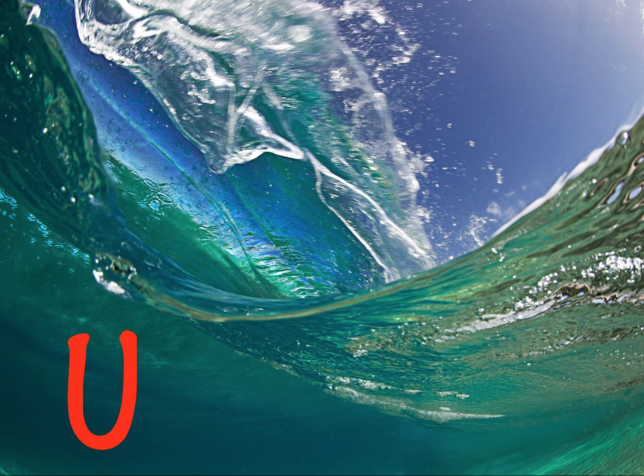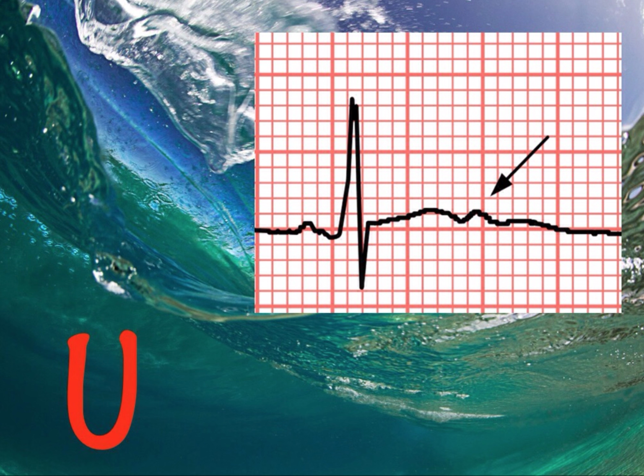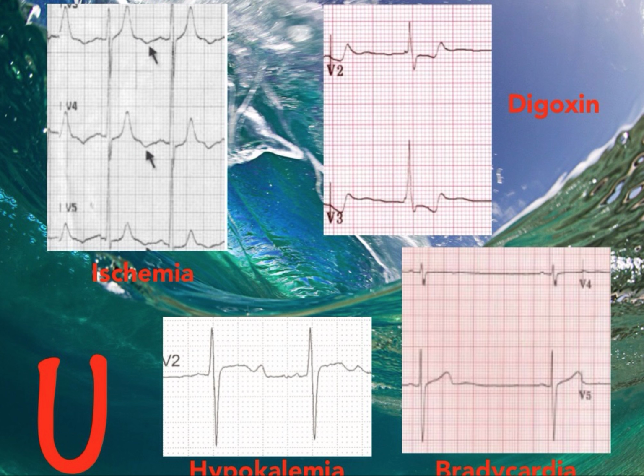First wave we're going to talk about is U wave. Everyone kind of knows what these look like. Do not get this confused with a different kind of U. This U is the most friendly U on the farm, apparently, on the website that I looked at. So here's the U wave we want to talk about. It is this upward deflection right here after the T wave. We're familiar with that, so we're not going to spend a lot of time on U waves.